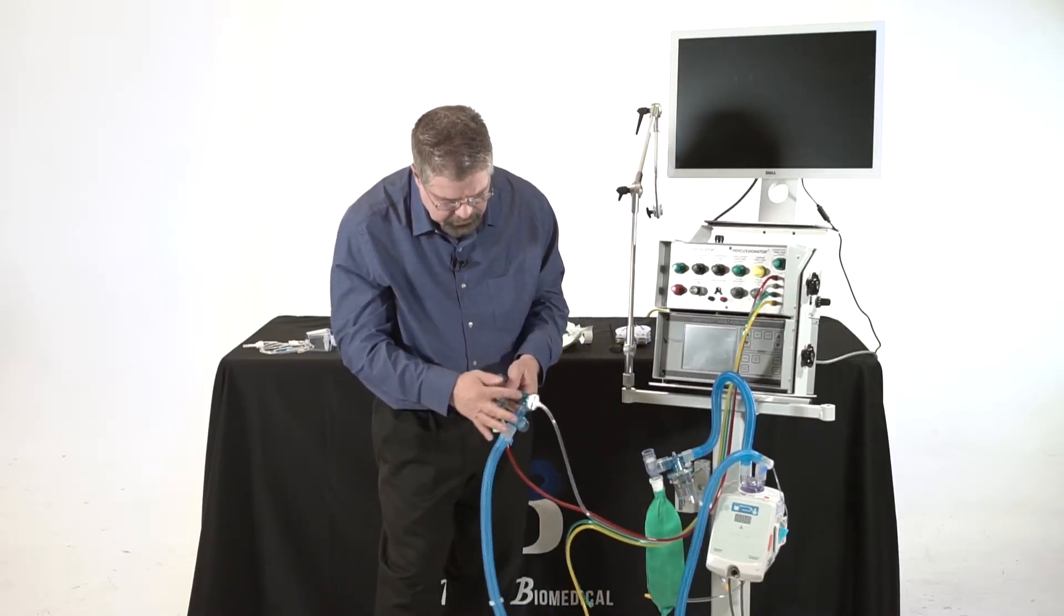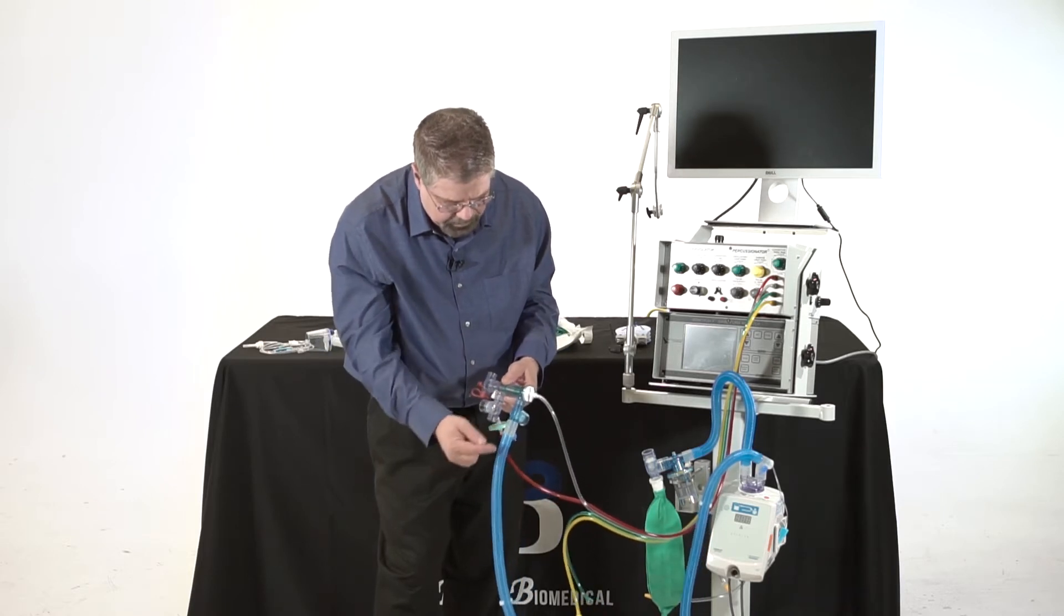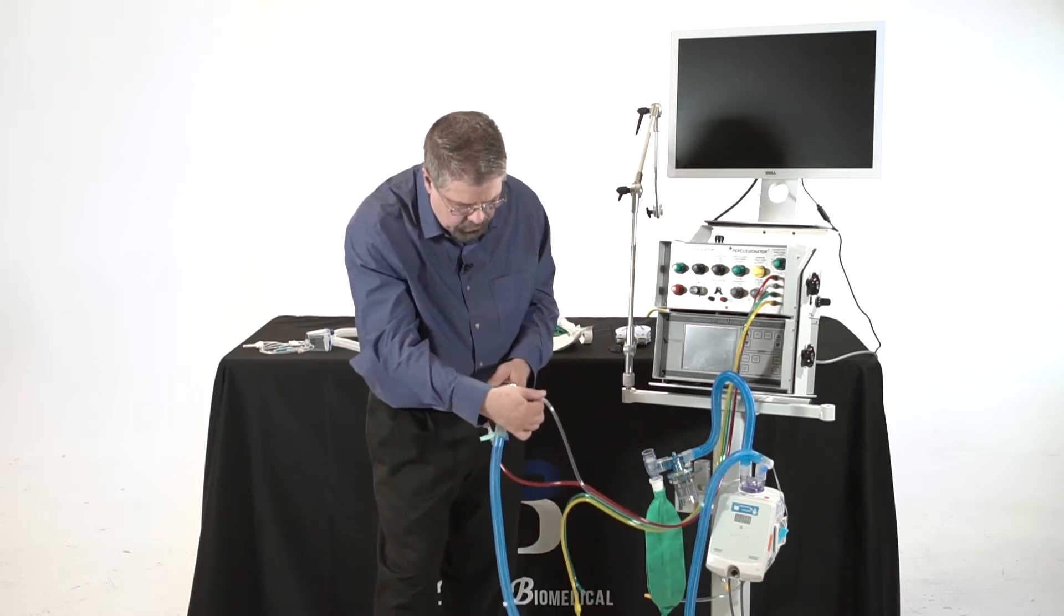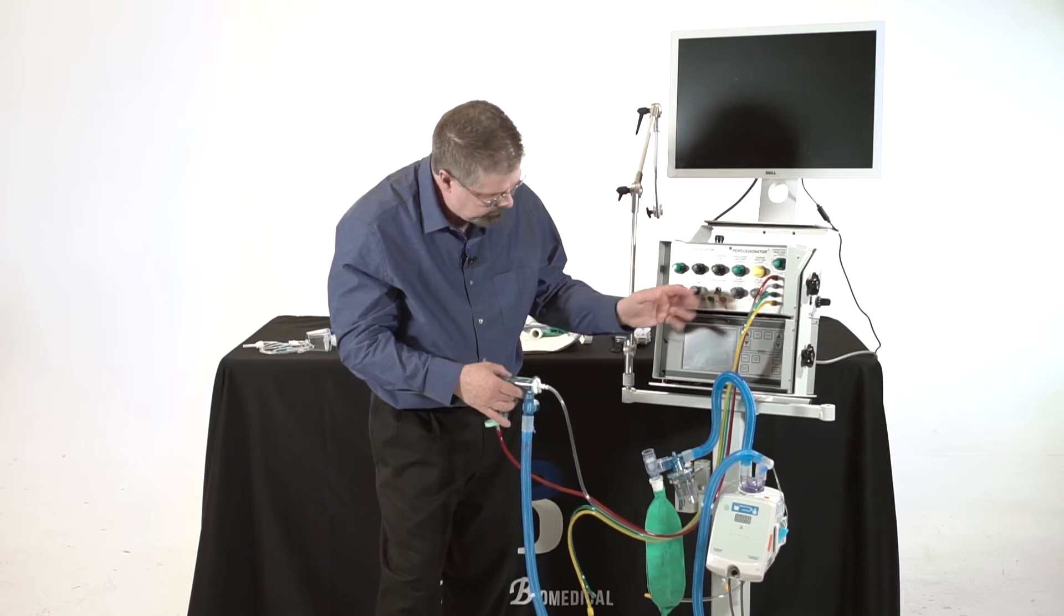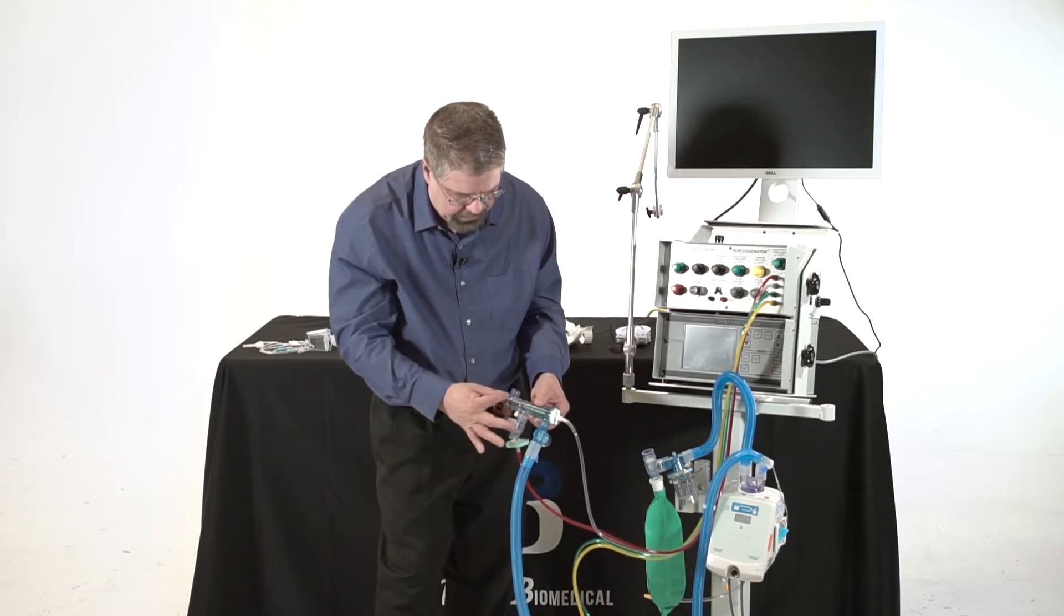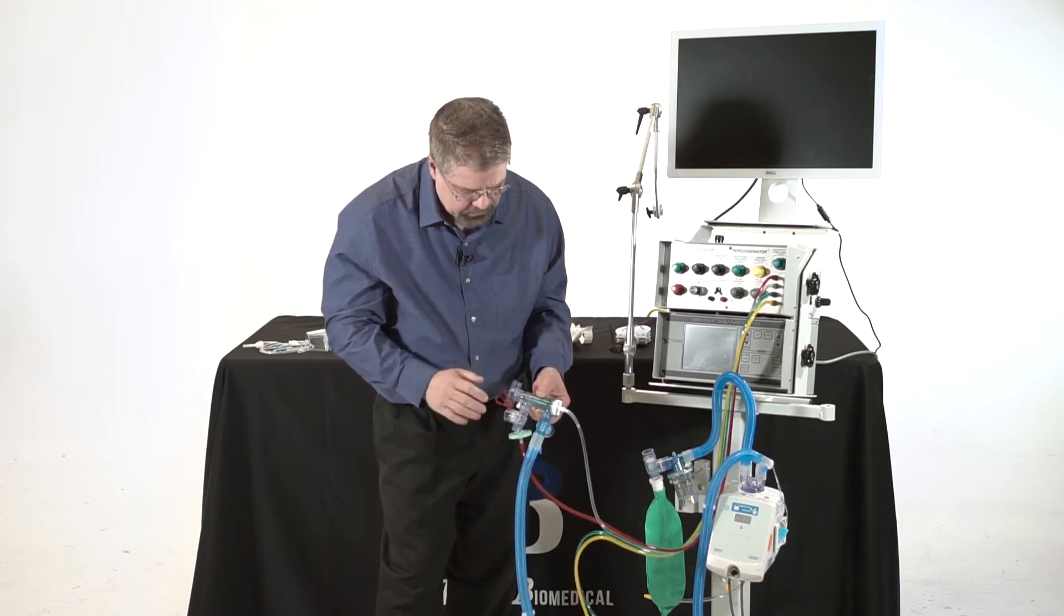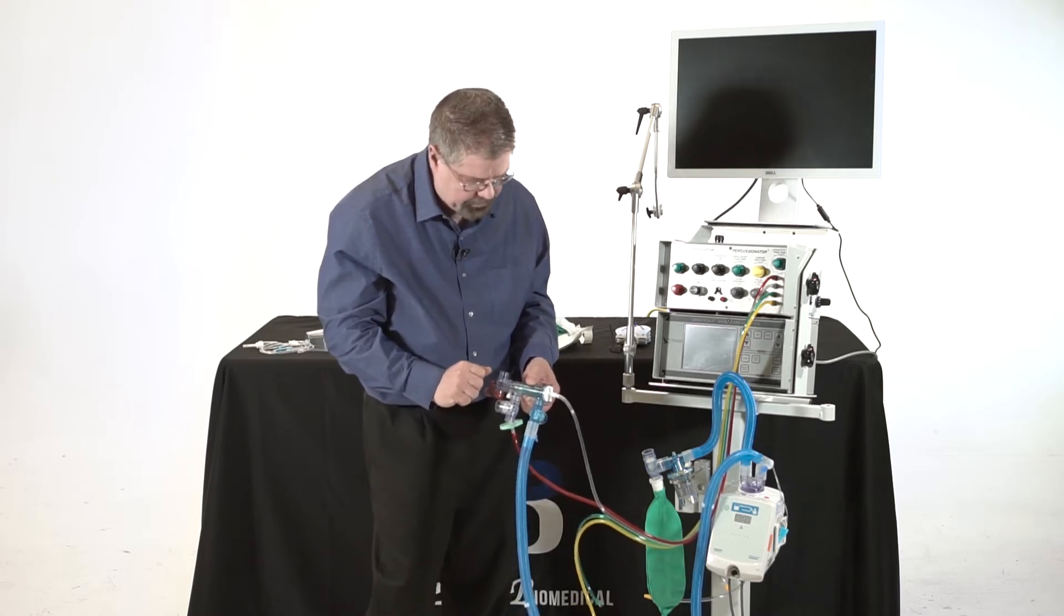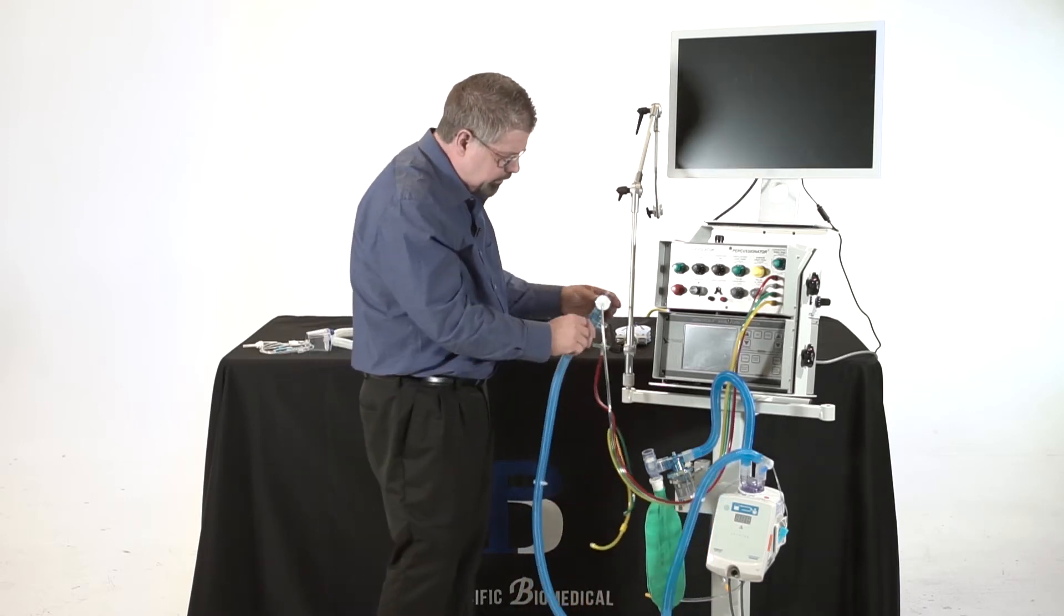I have my inspiratory limb going here. In another video we'll talk about the physics of the phasotron, but basically you and me build flow from the ventilator here, but it also entrains flow. These two flows go together and go out the phasotron. I still got to put my expiratory limb together, so let's put this over here for one second.